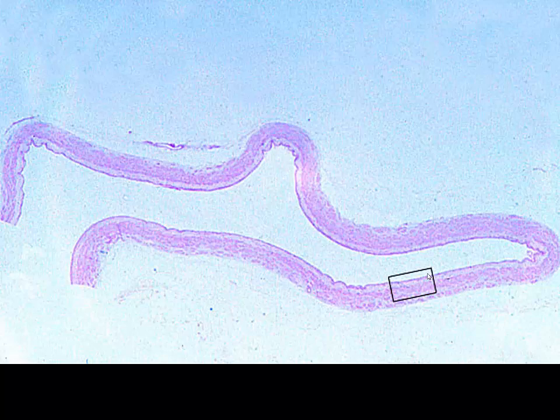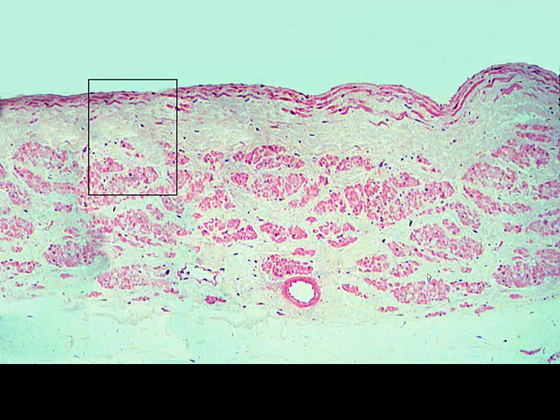All right, getting back to our H&E stain that we're fairly accustomed to seeing by now, we're going to look at various insets of this large vessel. And again, whenever we're looking at the folded lumen, almost collapsed lumen, that's sort of my first indication that we're looking at a vein. So we'll take that inset and look at higher magnification. Once again, we can see the lumen near the top, the intima, a few smooth muscle cells, and then mostly we're looking at our adventitia layer.